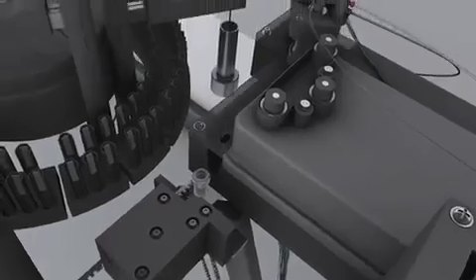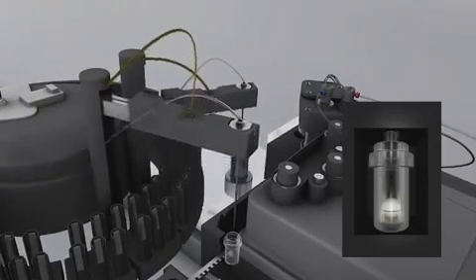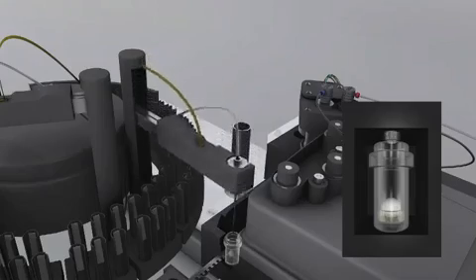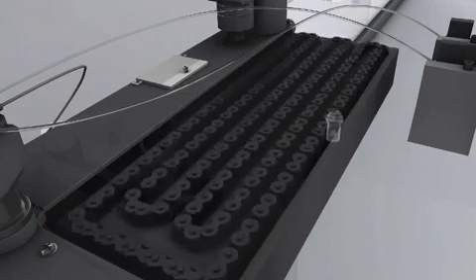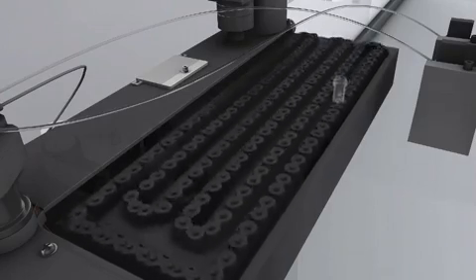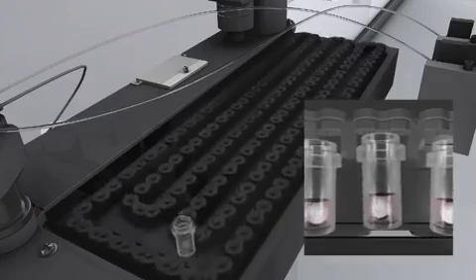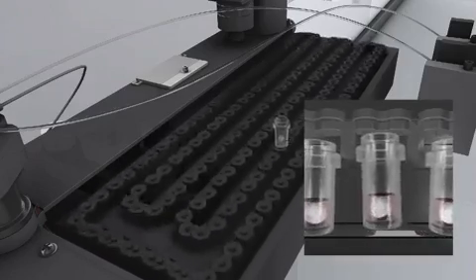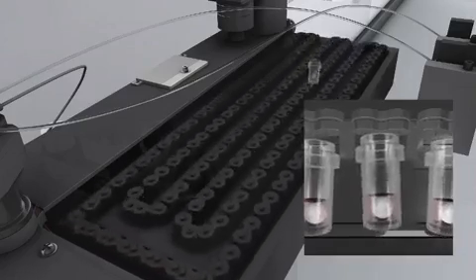The tube is then transported to the top of the instrument, where a shuttle pushes it into the pipetting position in the incubator. The sample and reagent pipetters draw the appropriate patient sample and reagent from the sample and reagent carousels and dispense them onto the bead. The test-specific bead, patient sample, and reagent are incubated together in the reaction tube. During the incubation period, the tube is in constant motion, actively agitating the reaction tube to maintain optimal reaction kinetics.